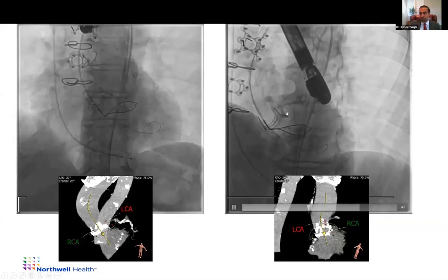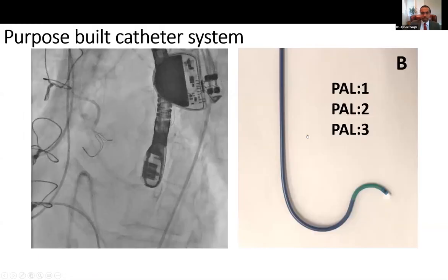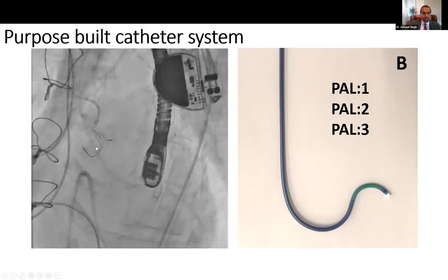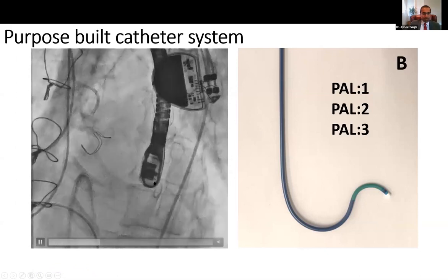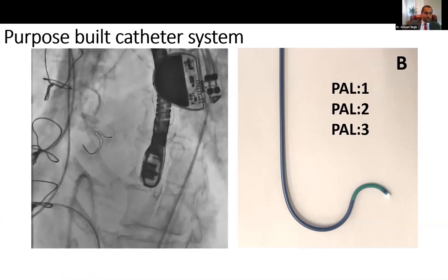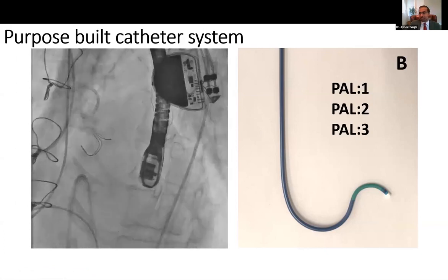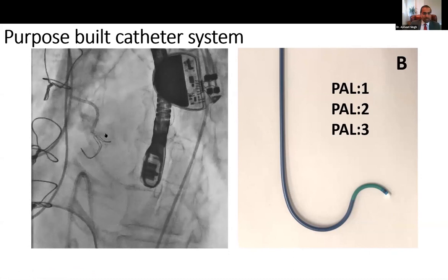And this was where the left main was coming off from. So these are the catheters that we're using. These are dedicated catheters, and these can be obtained from the Medtronic vendors, and I think there are some more companies coming up with dedicated catheters to help engage the cusp.